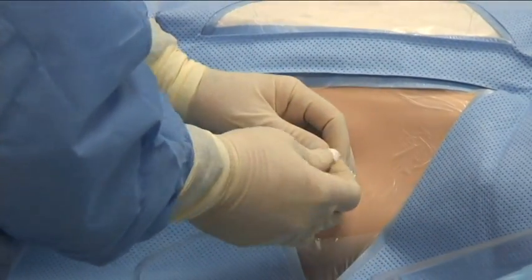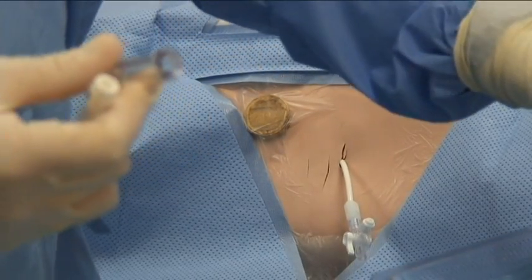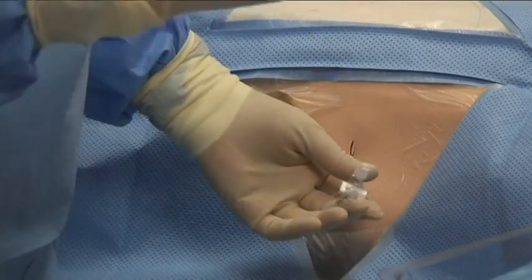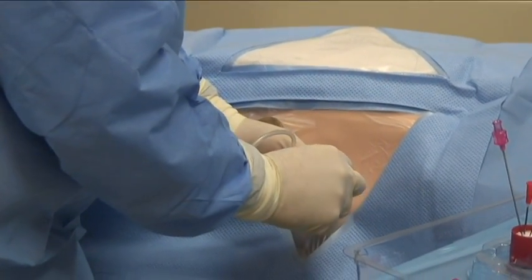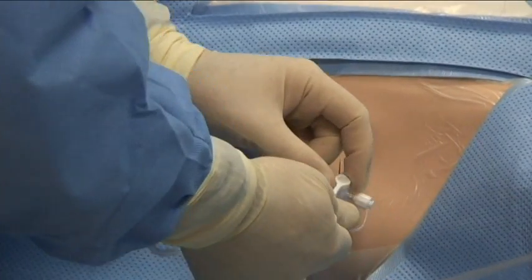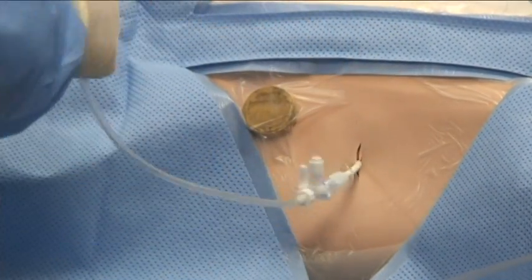The way that's done is attaching the, if you're going to go to the pleurovac, you don't actually want to use that. You can just do the pleurovac. But the connector tube here will connect to the end of your catheter, and then open up the stopcock so that you have the on position going to this end.